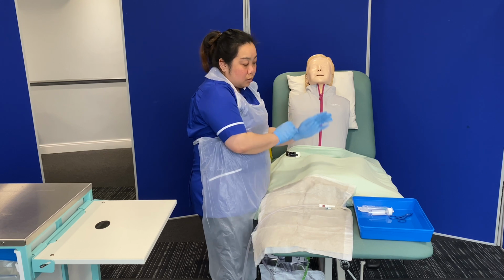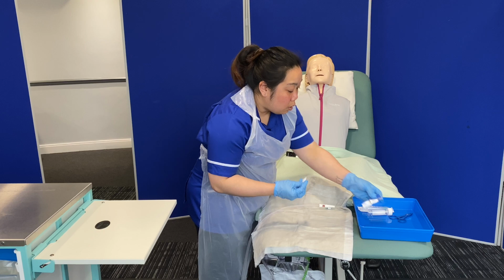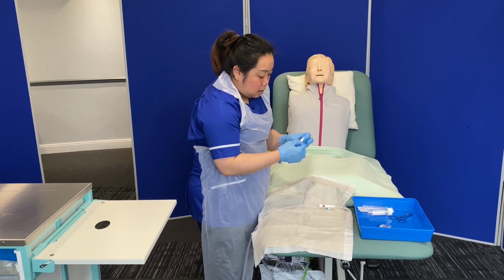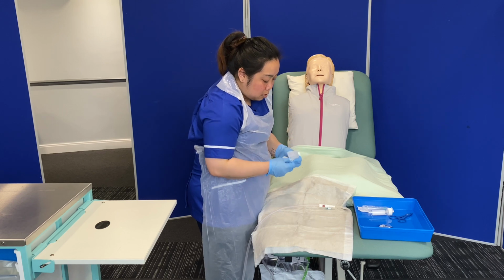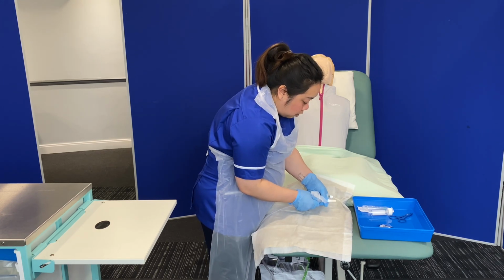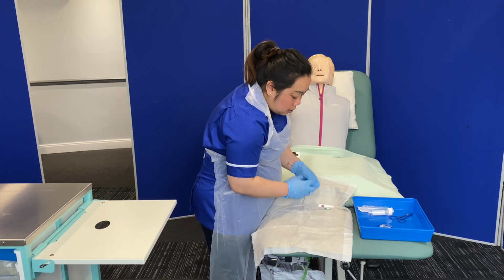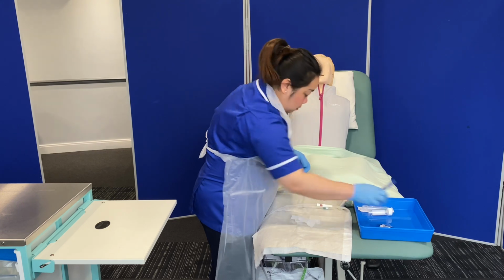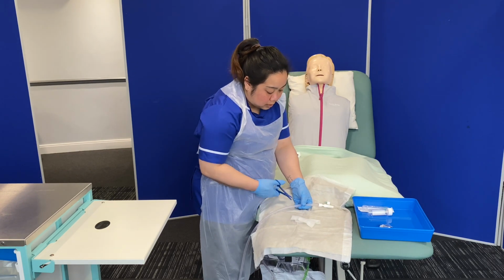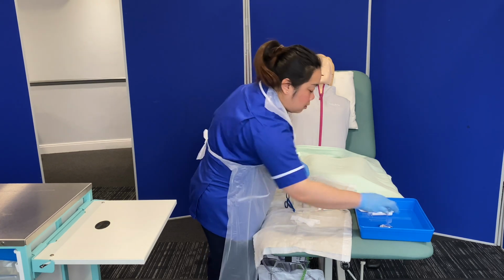So I'm going to first clean the tubing, Lindsay, before we collect any urine sample. 1, 2, 3, 4, 5, 6, 7, 8, 9, 10, up to 30. I'm going to put the clamp in distal to the sampling port. Right, that's set.